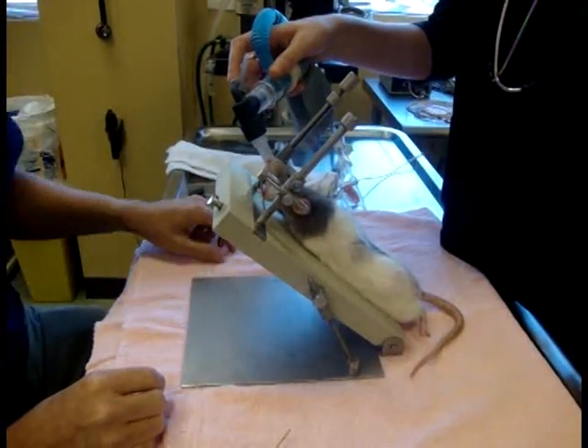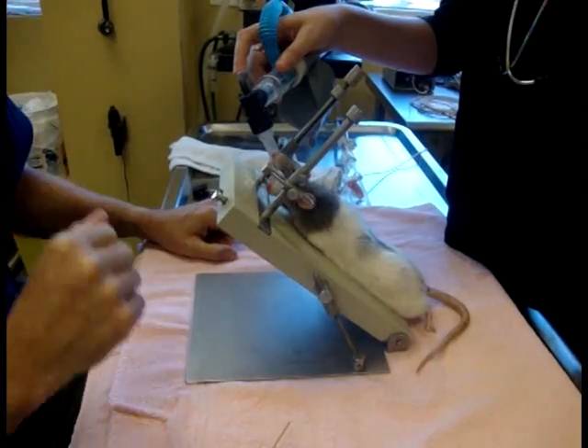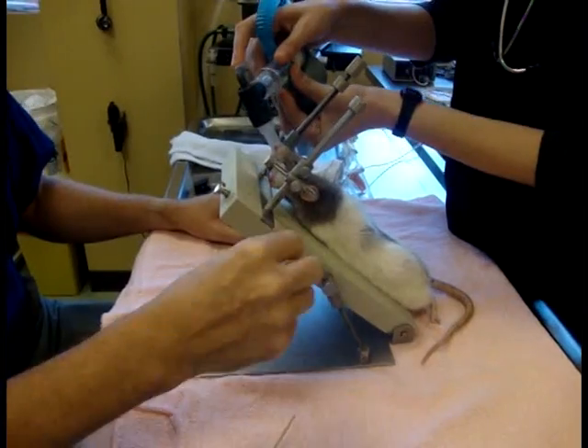He's an obligate nasal breather, so he's able to breathe through the nose only while I work in the mouth, until I get the epiglottis flipped out of the way — then he will be able to breathe through the oral cavity.